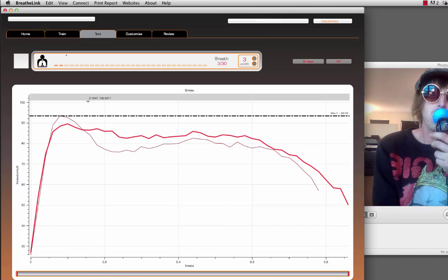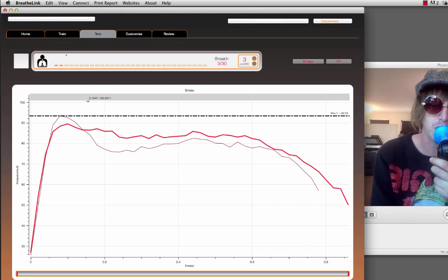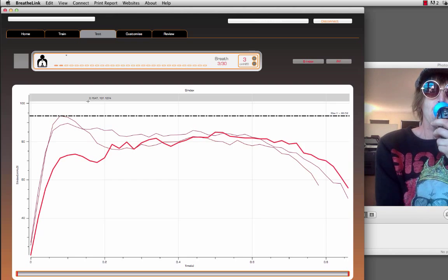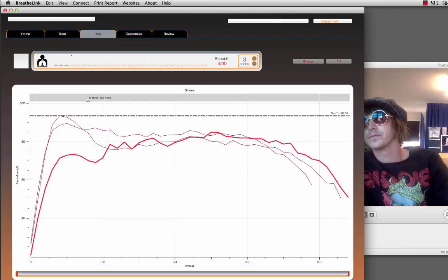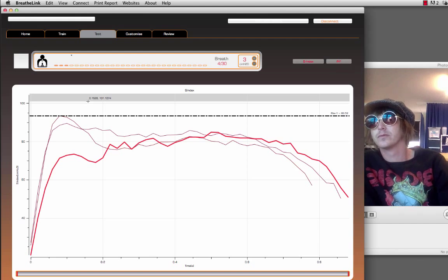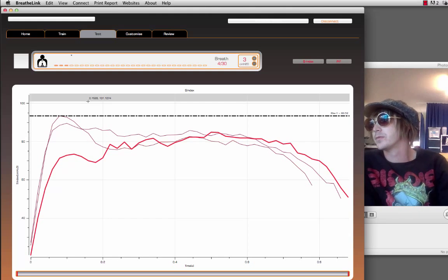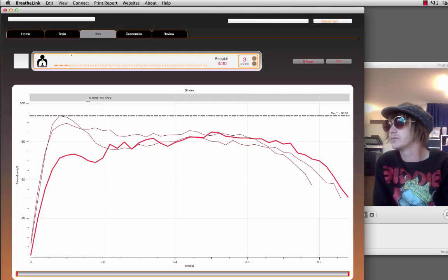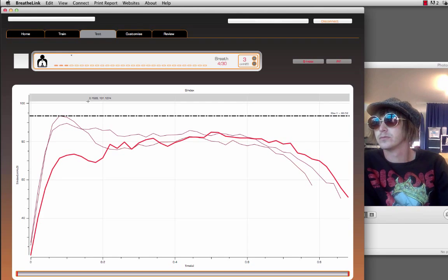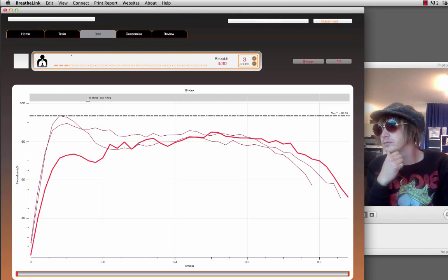Good. Breathing out. So we'll just do it nice and slowly. All the air out, all the air out. One more time. Good. Okay. So you're at 93 centimetres of water pressure. I'll go downstairs and check what you were last time. We can improve. I would want to see you around 140. That way, with a stronger diaphragm, we can increase flow rate. So without a doubt, we're going to get that air in quicker. Without a doubt, we can increase the volumes as well.